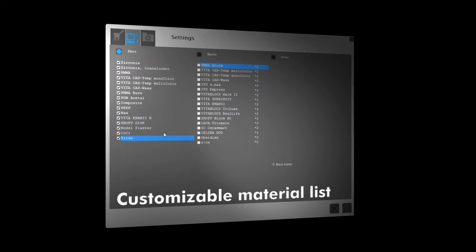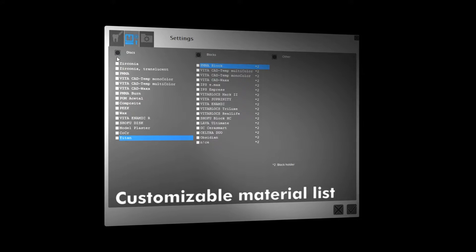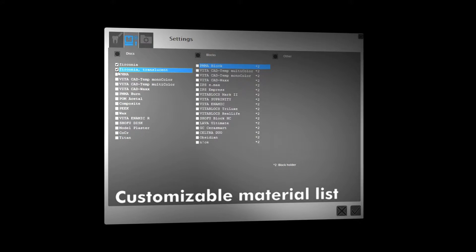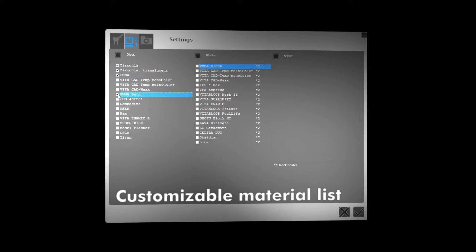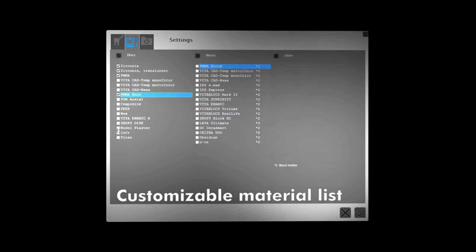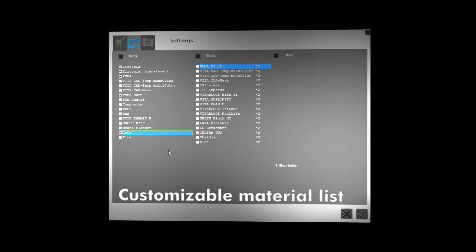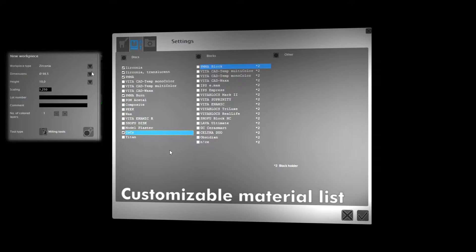The material list, however, is now customizable. You can activate just the materials you use regularly, creating a more efficient workflow. This makes creating jobs even easier.